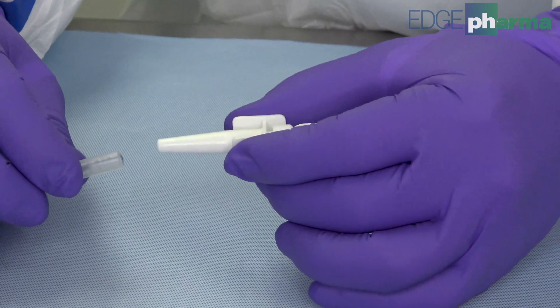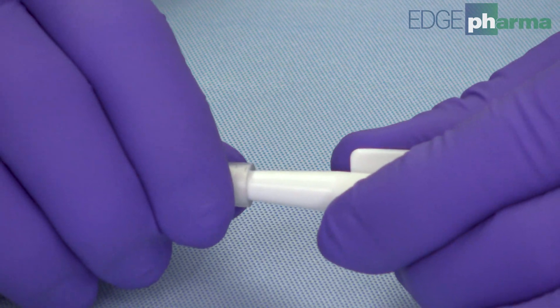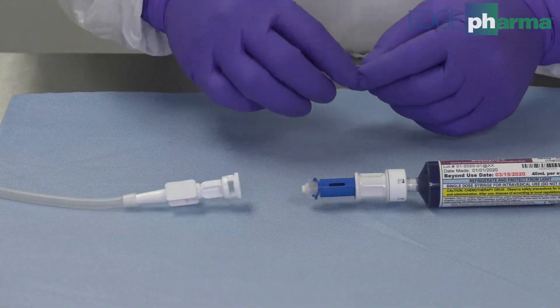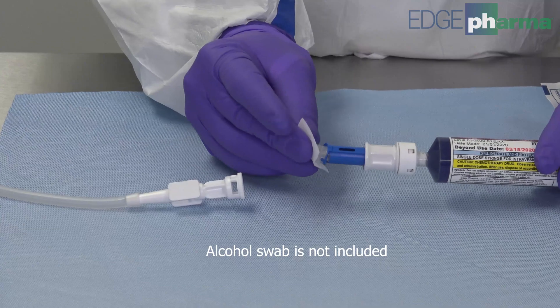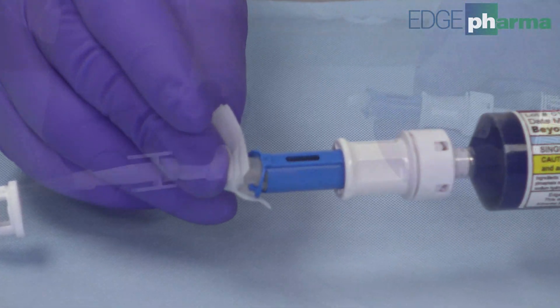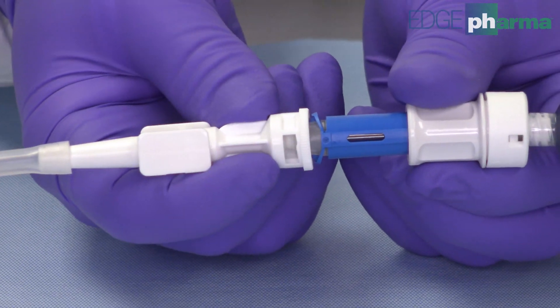Insert the catheter tip into the opening of the catheter tubing. Use an alcohol swab to clean the end of the closed system transfer device. Affix the closed system transfer device to the luer lock adapter.